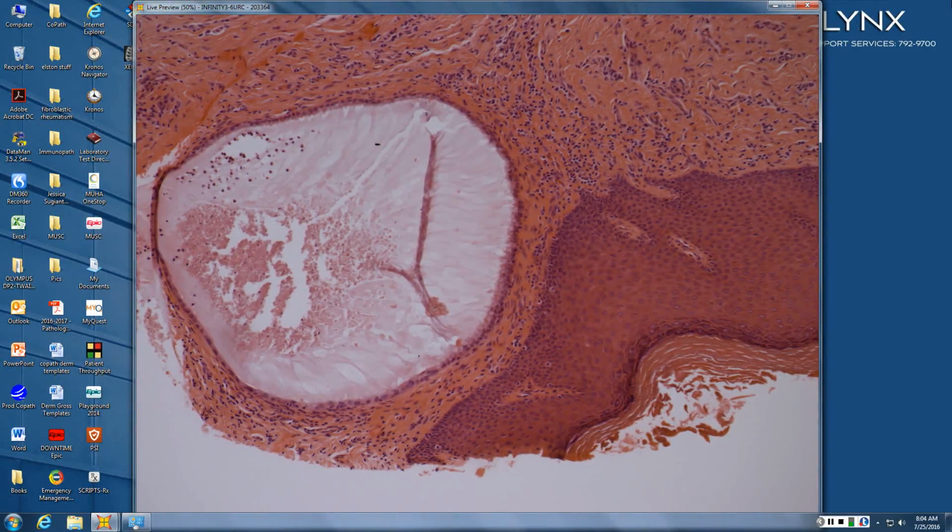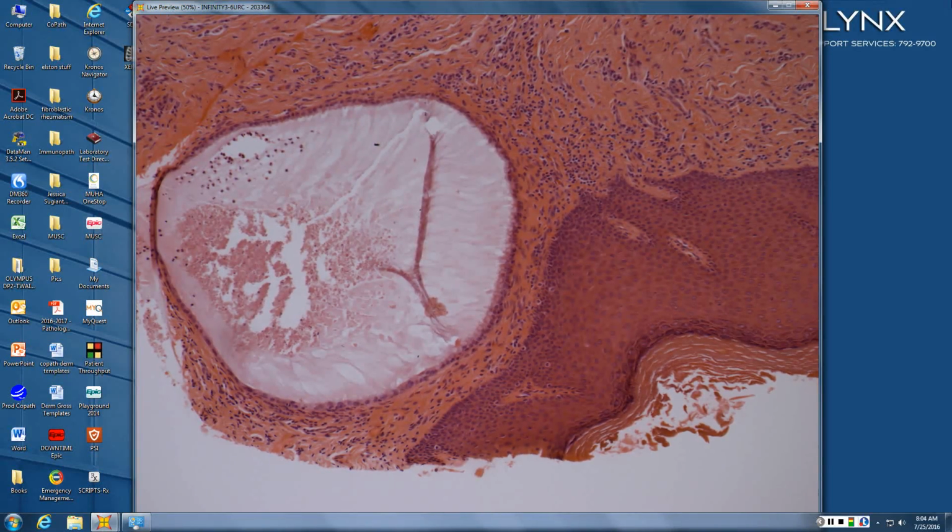And then, is it empty or is it filled with guck? Filled with guck. So a guck-filled cyst with a simple epithelium is most likely located where? Is it like a ciliated cyst? Maybe. So a ciliated cyst on the leg of a woman, or median raphe cyst in a guy.